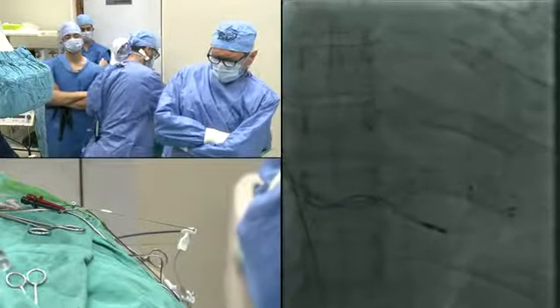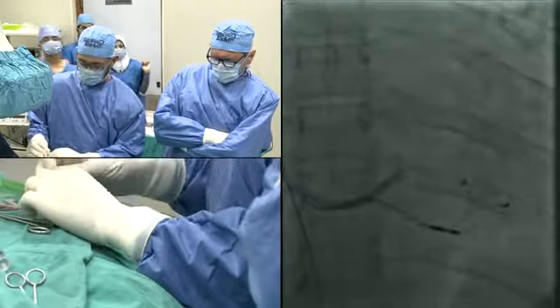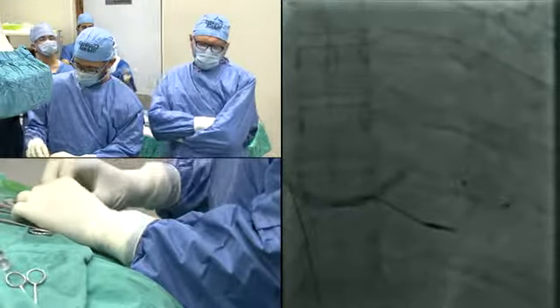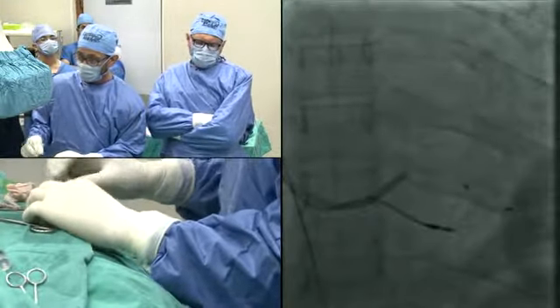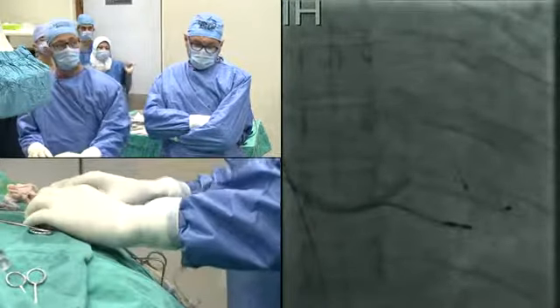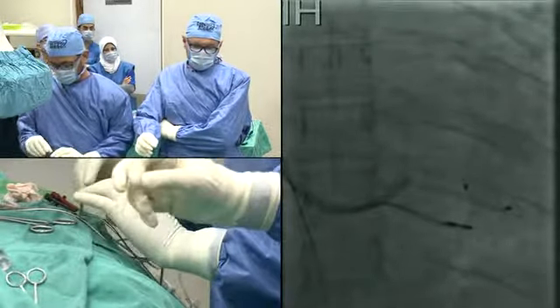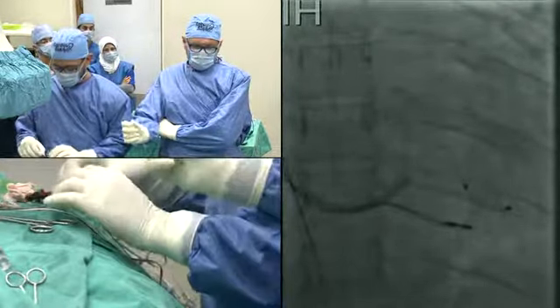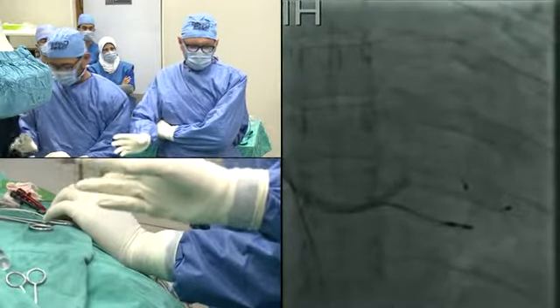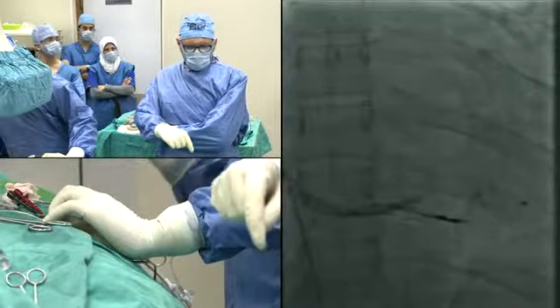Do I usually use CT angiography? No, not typically. We typically go with the approach we've taken here, which is to do a basic angiogram during the procedure to define the anatomy, not previously to the procedure.